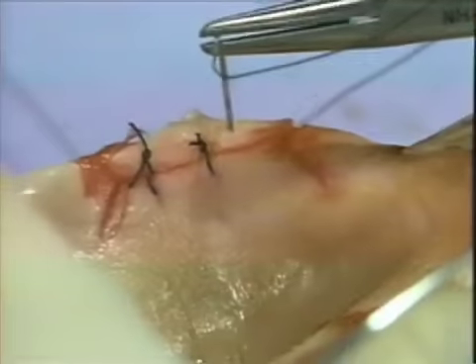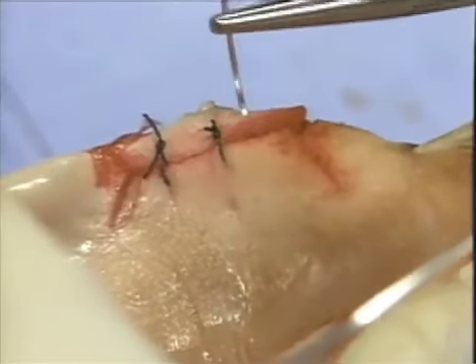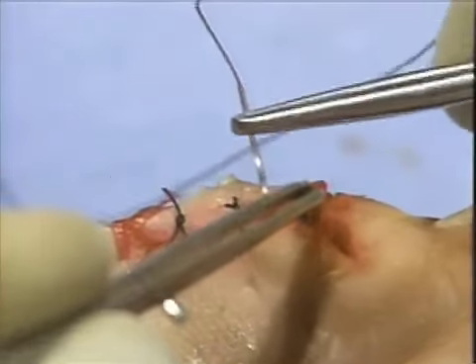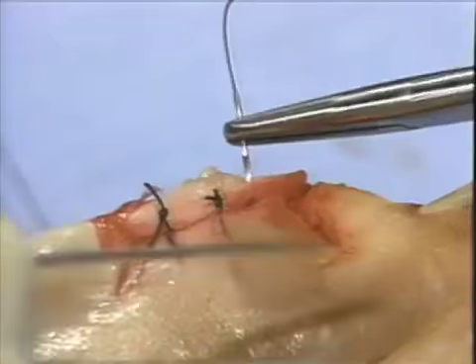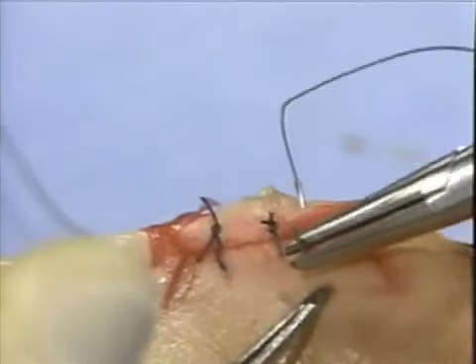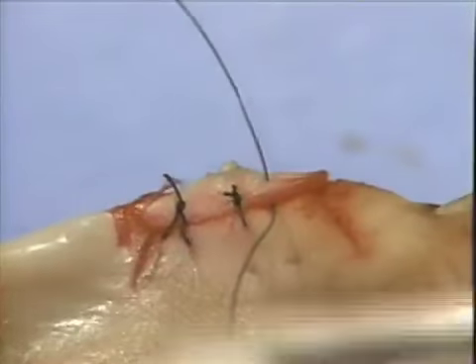We will now demonstrate a horizontal mattress suture, in this case an external horizontal mattress. This suture is called a mattress suture because it allows the bulk of the suture to lie on tissue as on a mattress. This suture technique has definite advantages in situations such as bone grafting, guided tissue regeneration, or where preferential coronal positioning of a flap is required.